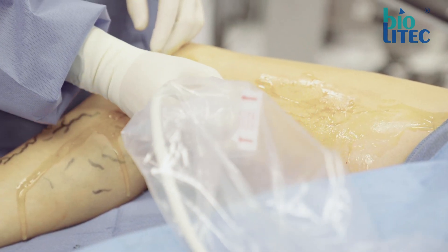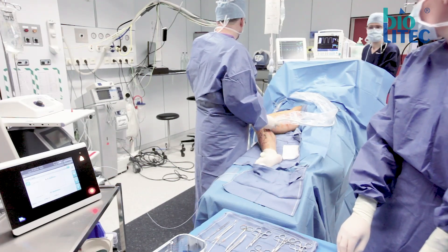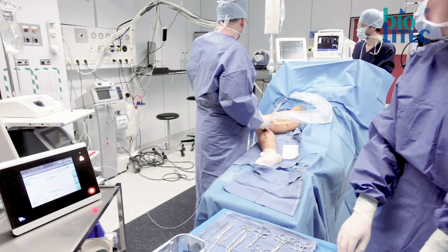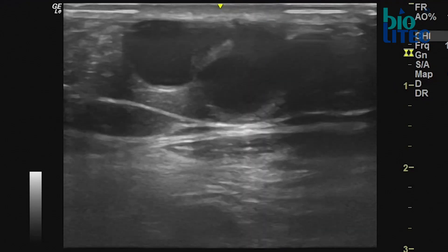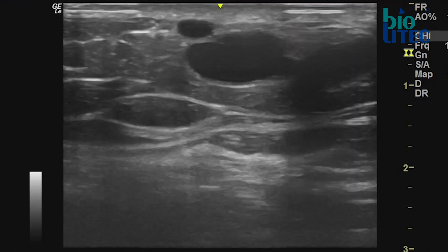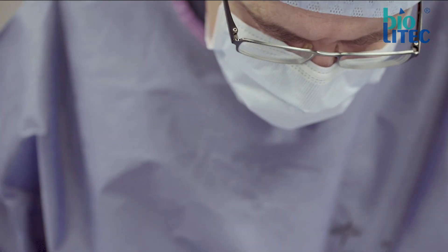Small side branches, especially in the upper part of the greater saphenous vein, are marked by a stab incision and interrupted by a phlebectomy later on. Personally I am convinced that this reduces the risk of failure of obliteration of the GSV by prohibiting residual flow.